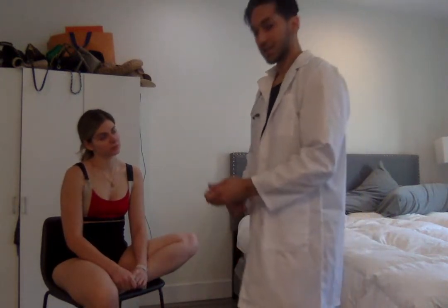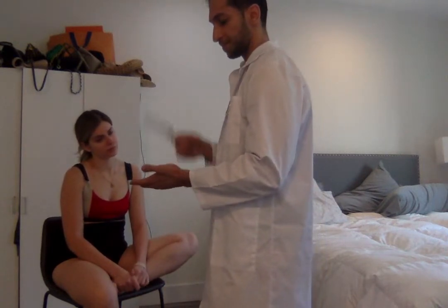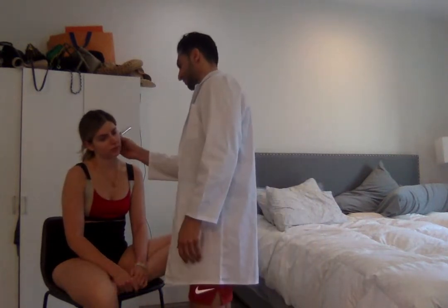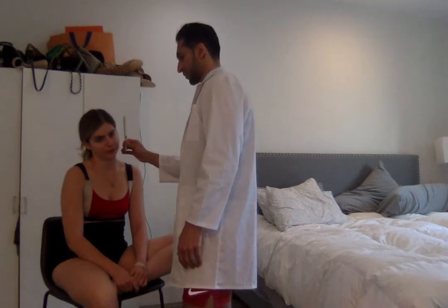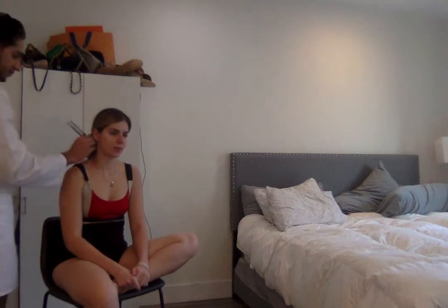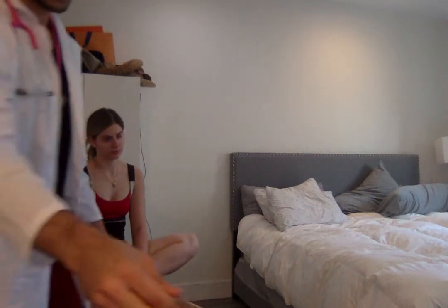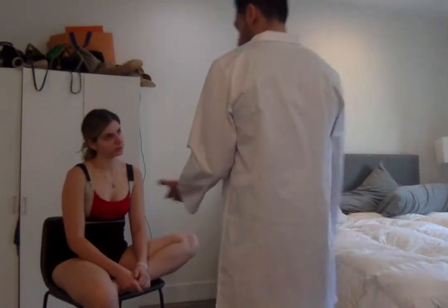Now we'll do the Rinne test. I'm going to strike the tuning fork, place it on the mastoid, and then move it to the side of her ear and see where she hears it more. All right. Now. Okay. Now what about this side? Now. Okay. So those are normal findings. Air conduction is greater than bone conduction.